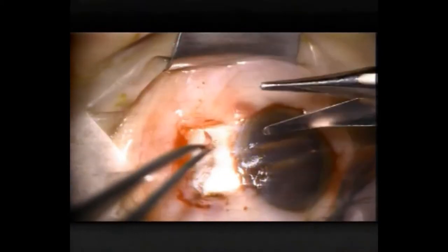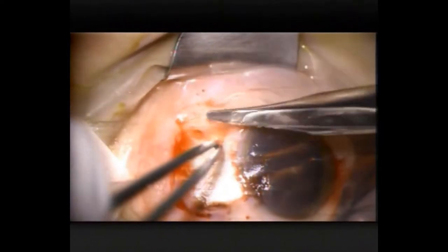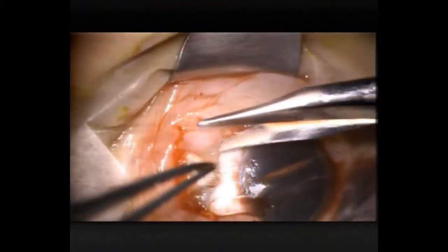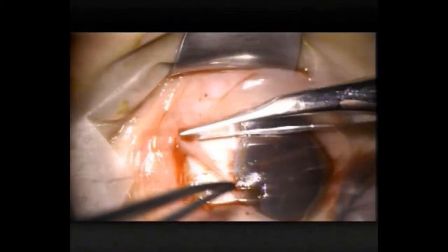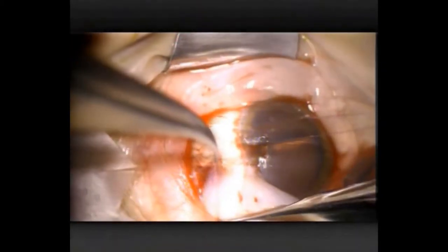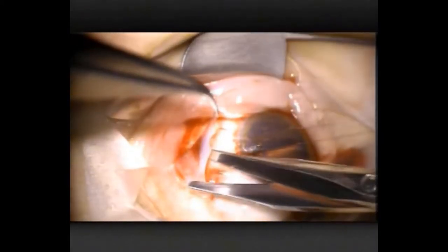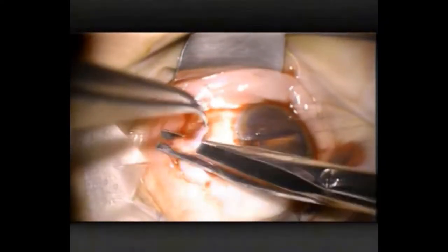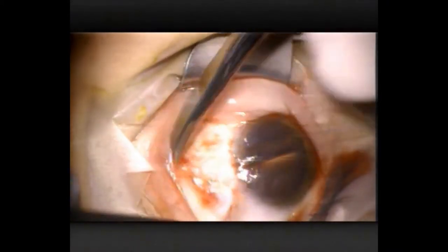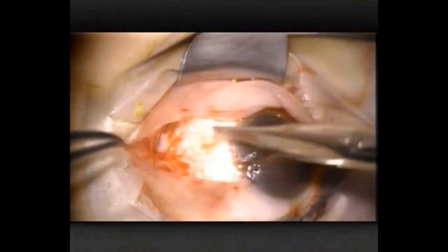Now I'm teasing out some Tenon's capsule from underneath the conjunctiva. I think this is useful — Tenon's is very good at contracting post-operatively and dragging the tissues around, so if you don't have it there I think it's an advantage. Episclera can be removed as well. When you're dealing with that superior Tenon's, you want to be careful you don't drag down the superior oblique muscle, and obviously medially you're trying to avoid the medial rectus.